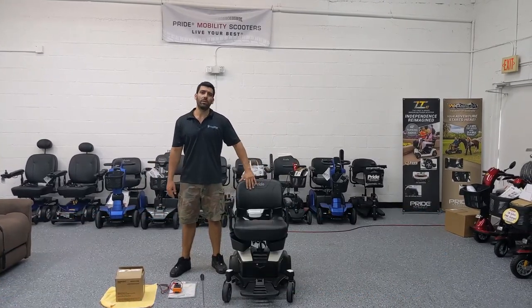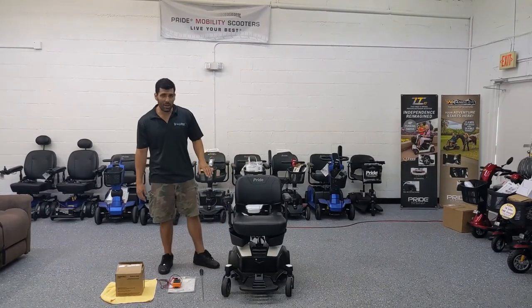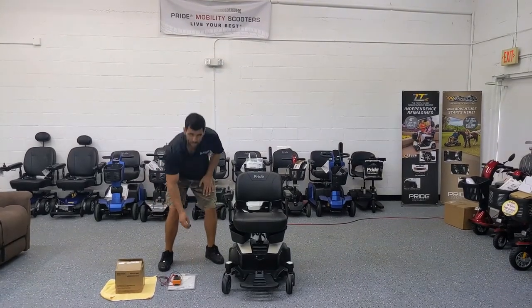This power wheelchair happens to be the Go Chair by Pride Mobility, and it comes with a battery box that you're going to need to take apart in order to access the batteries.